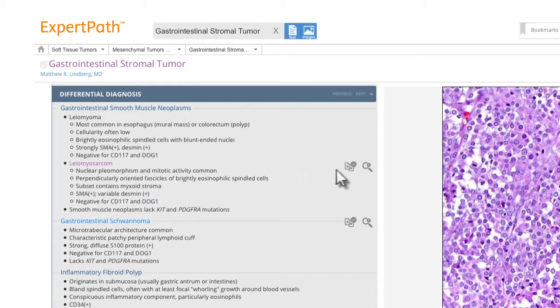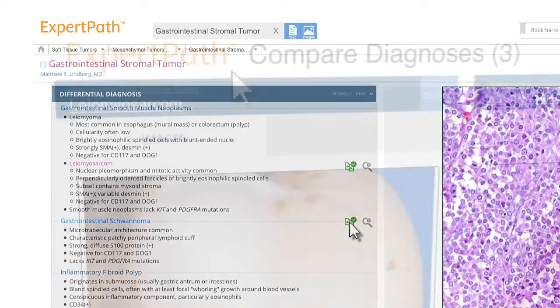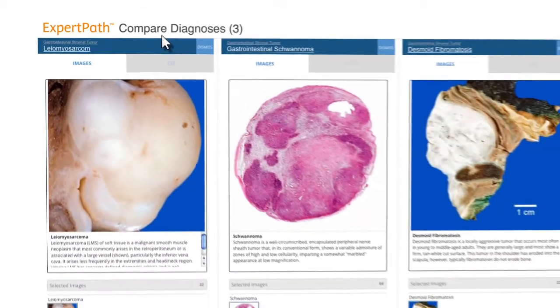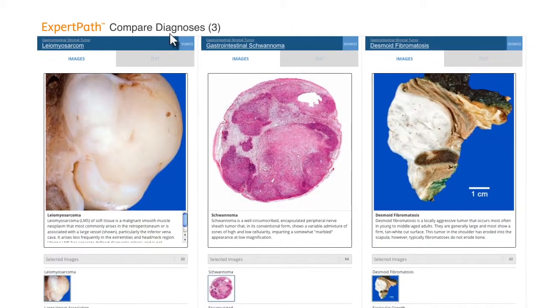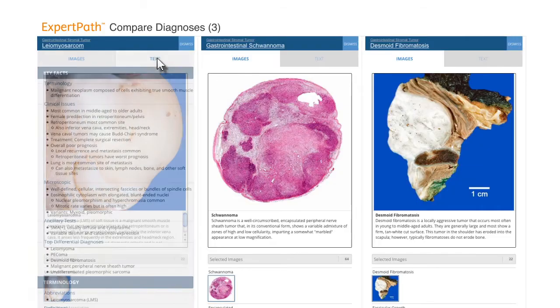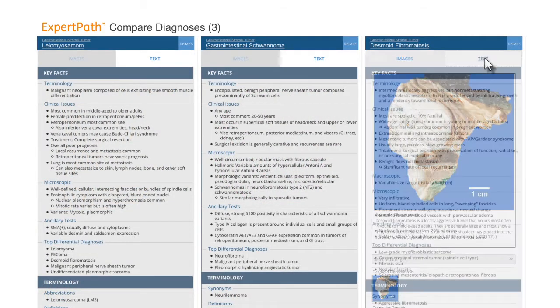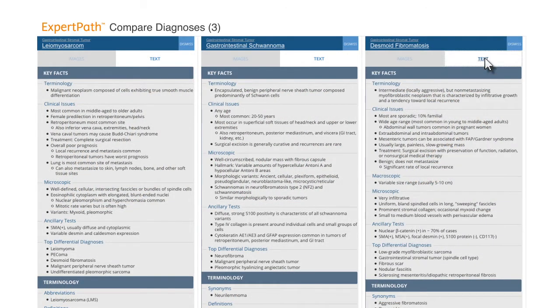Diagnoses of interest can be bookmarked or saved for a later comparison. Expert Path's compare feature allows for easy and direct side-by-side comparison of images and text to help distinguish between diseases.